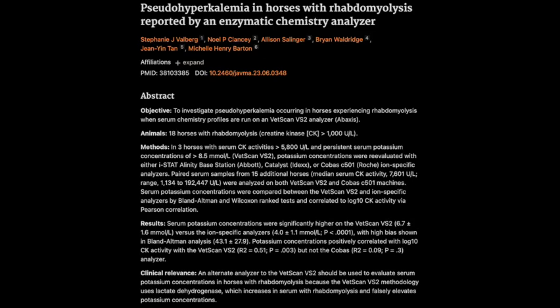Today we're going to be looking at something that can be a real head scratcher in equine medicine. It definitely highlights how important it is to really think about those lab results and not just take them at face value, especially when you're dealing with something like rhabdomyolysis in horses. It can get pretty complicated.